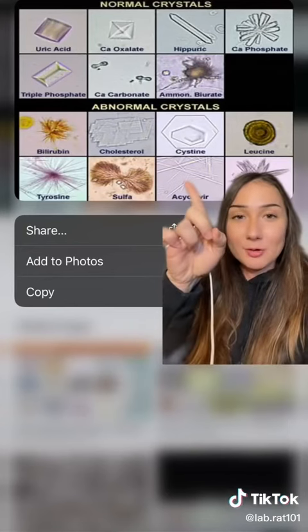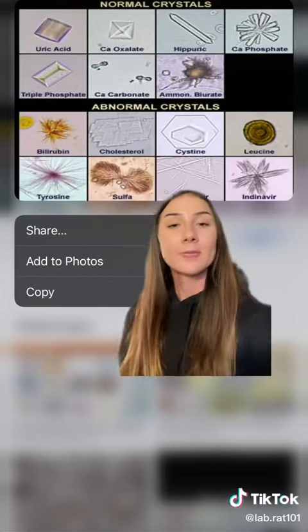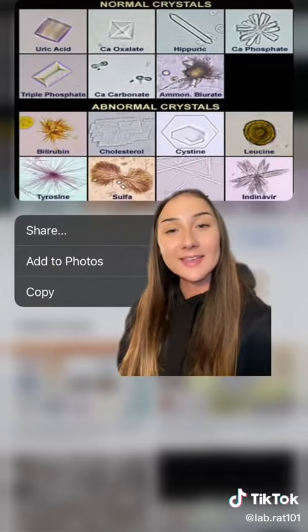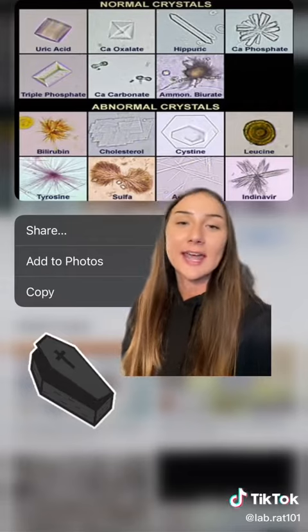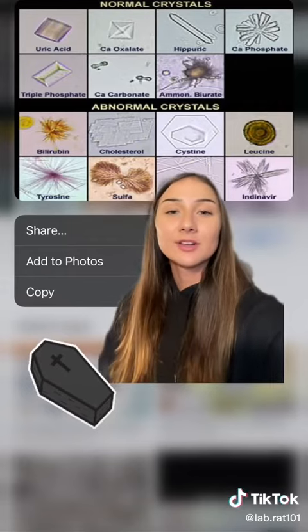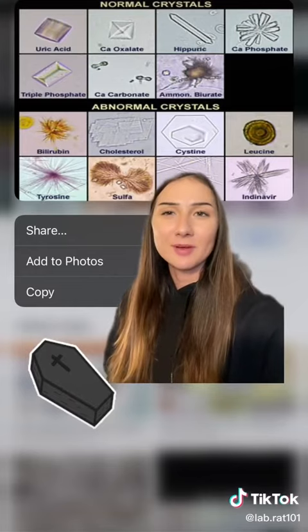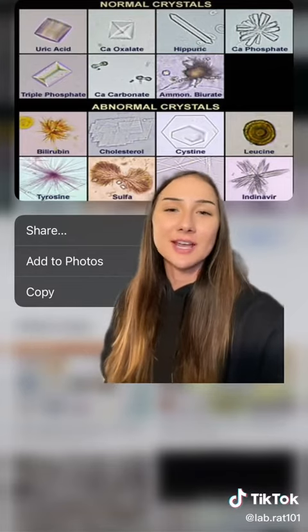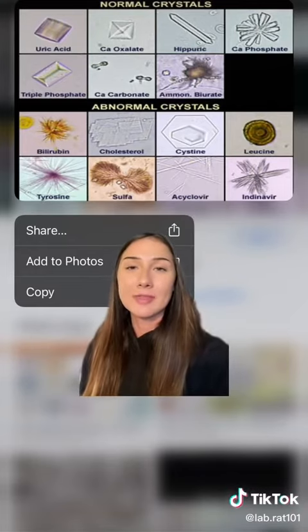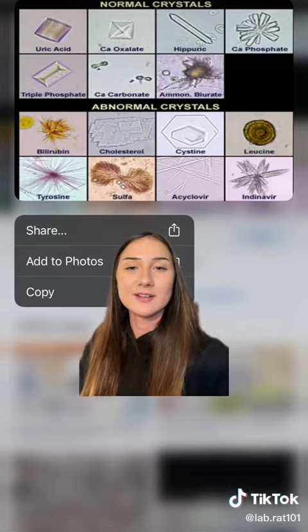There are two different categories of crystals in urine: abnormal crystals and normal ones. Triple phosphate crystals are found in highly alkaline urine and UTIs. They typically have no clinical significance, but they look kind of scary because they're coffin-shaped. Also, all abnormal or pathological crystals will be found in acidic urine.